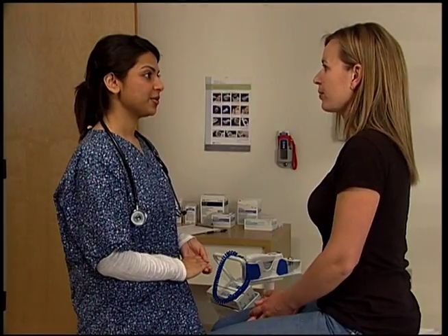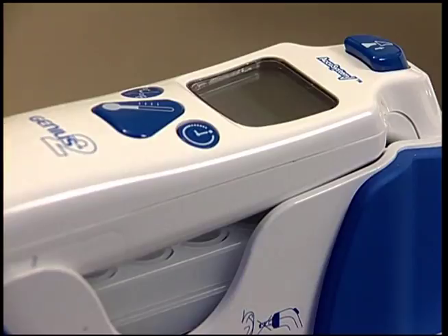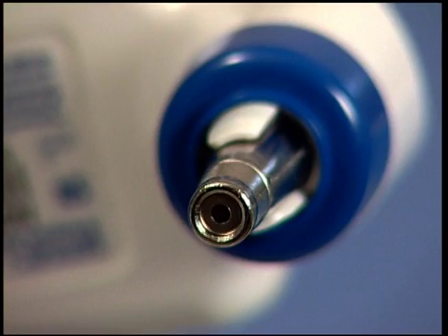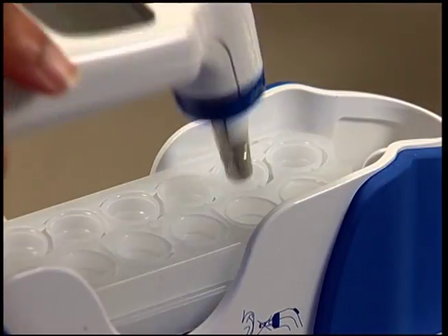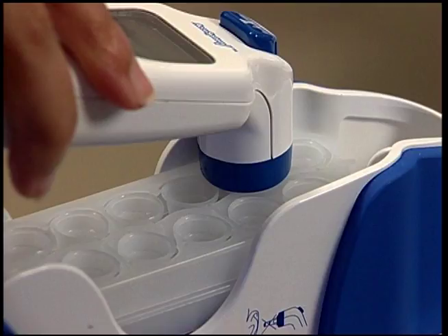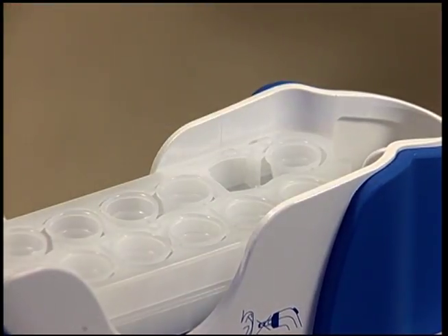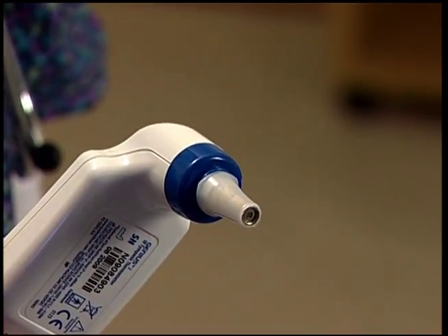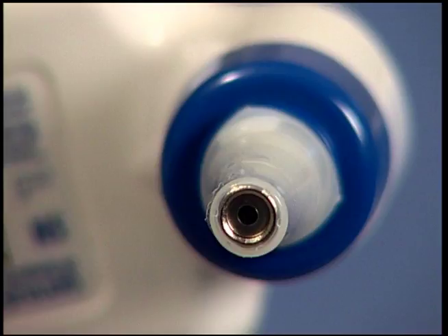For adult temperatures, first remove the thermometer from the base unit by grasping just below the release button. Inspect the probe lens to see that it is clean and free of cracks or debris. Push the probe tip straight down into a probe cover until you hear the click. Lift the Genius 2 out of the cassette with the plastic probe cover attached. Check to make sure the membrane on the end of the probe cover is smooth and the cover is securely attached.